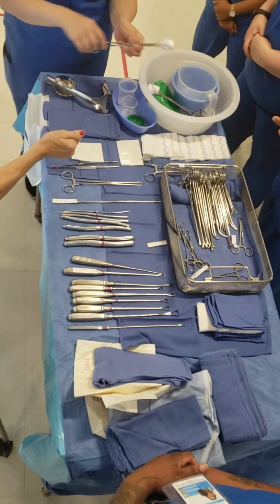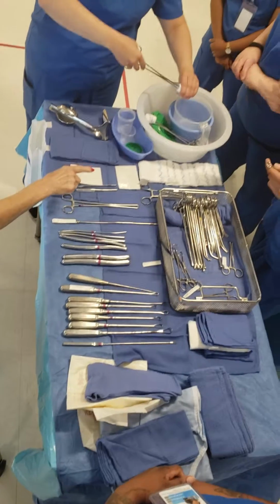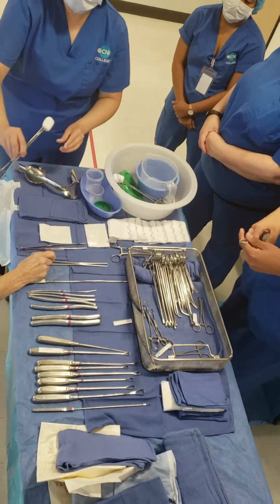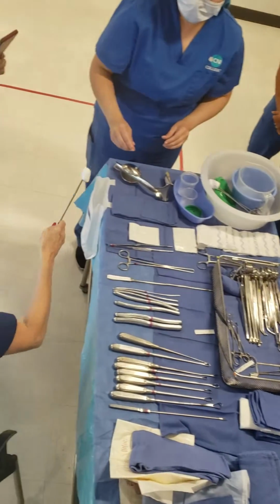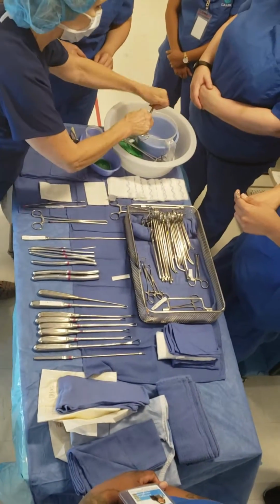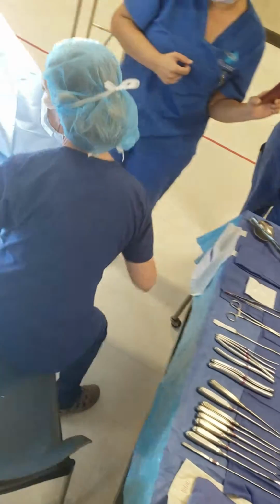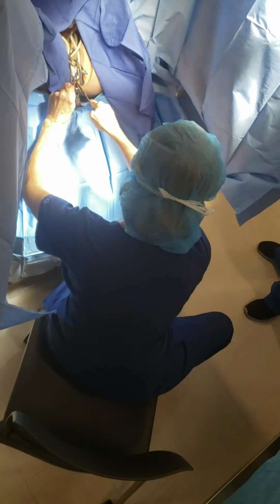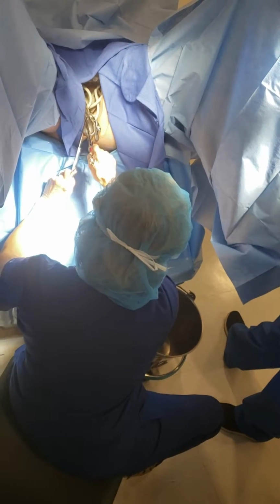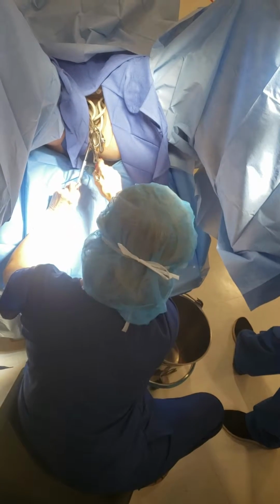Okay, then a sponge stick. You're gonna dip it and squeeze it out. No, with the hand. Squeeze it over. But you're gonna grab the end of it. So I'm gonna take this and then I'm gonna give it to her like that, okay? It's okay if you touch this. Most gynecologists and OBs are female physicians, usually. And they'll keep this in here and keep some pressure on it if the bleeding doesn't stop.